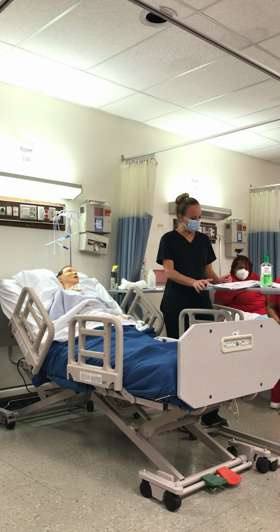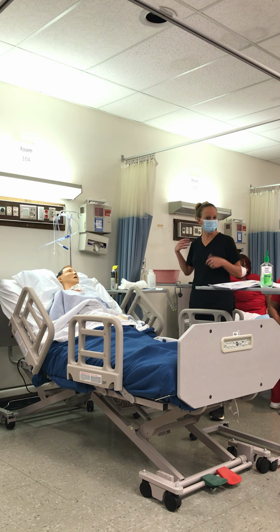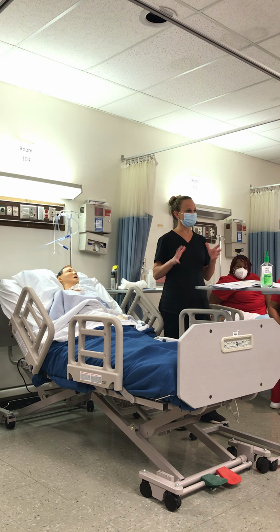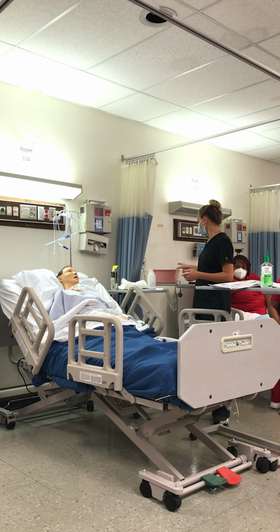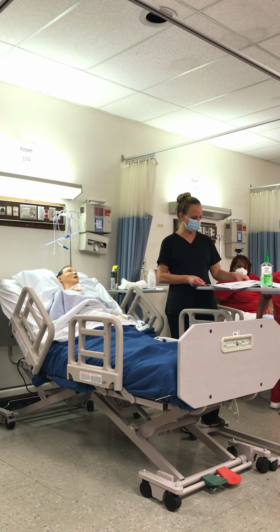Okay. So unwrap, and then if it felt too stiff, I could put it in a basin with warm water. Is that warm water sterile? No. Is that basin sterile? No. So my hands could possibly even be cleaner than what I put it in, but regardless, I would probably put gloves on. So we want to unwrap it.